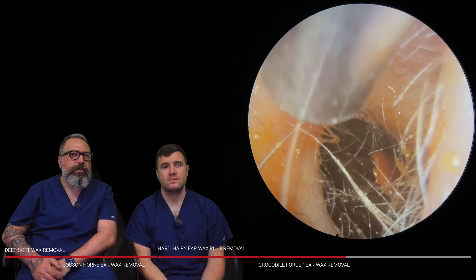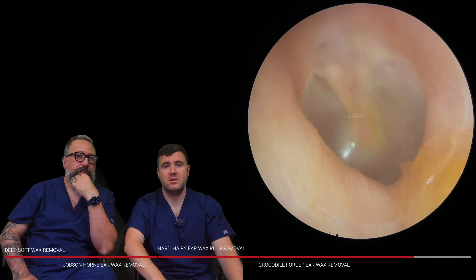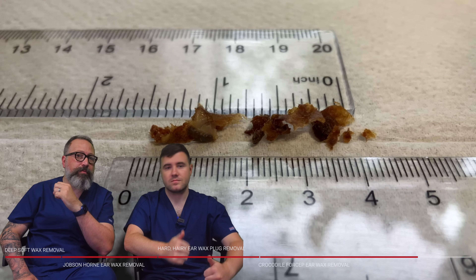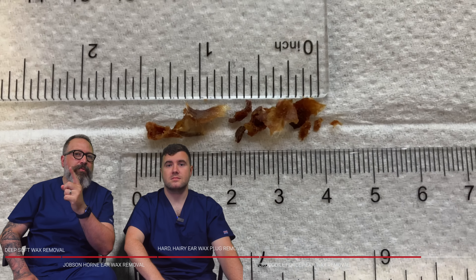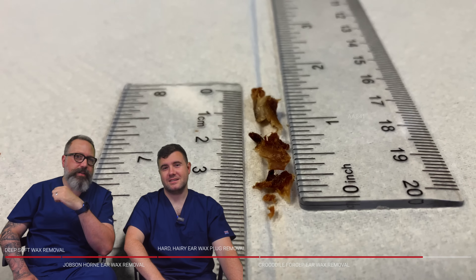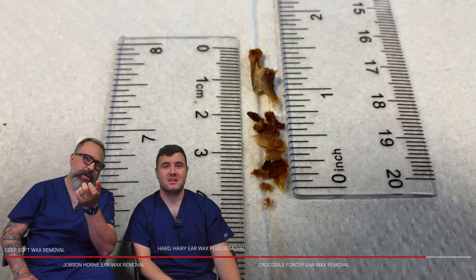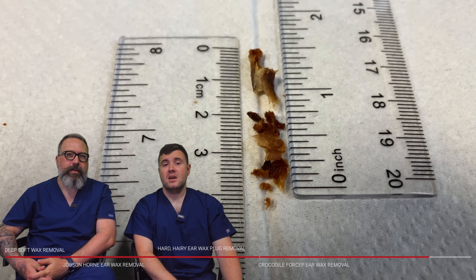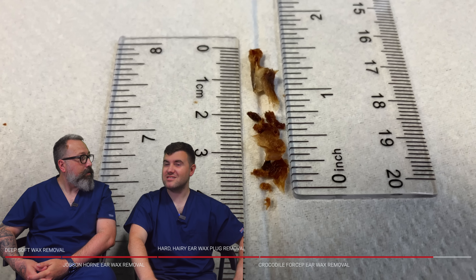I'm still getting used to these new rulers — that's definitely an inch; two and a half centimetres. I would have said this was your video but I don't know now. We've lost track. Do you know what, I'm going to get so much stick in the comments because everybody tells me off for talking over your videos — I forgot that was your video and I just talked straight over it again. That's all right. There was some wax in this patient's ears and we got that out — that's all we need.